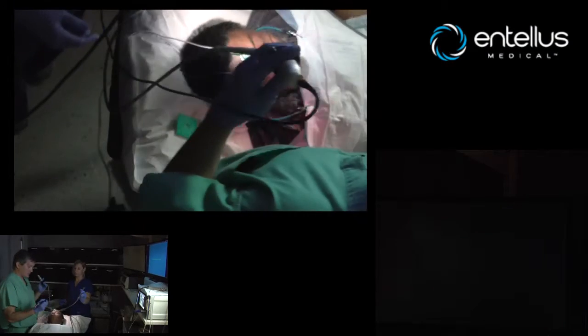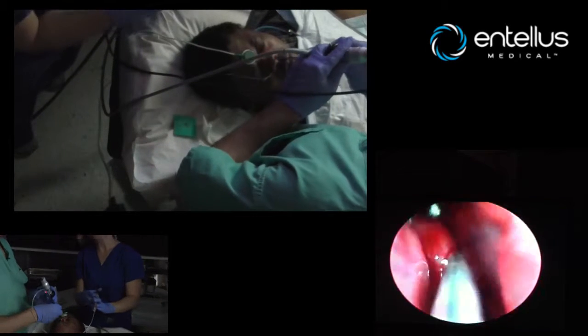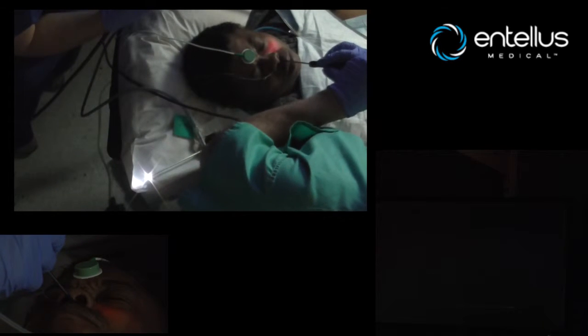Now we're going to go back and just show you with the Ultra. So it's standard balloon surgery — come in, tactile feel, trans illumination.